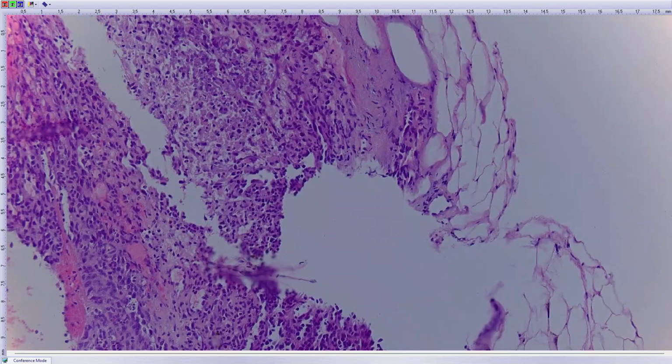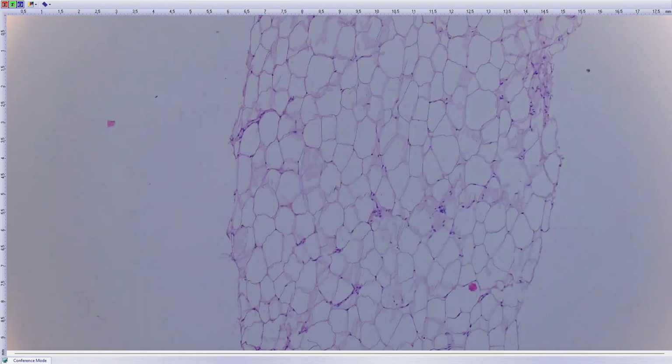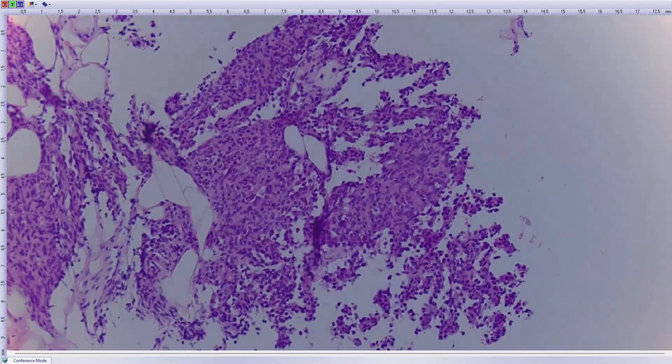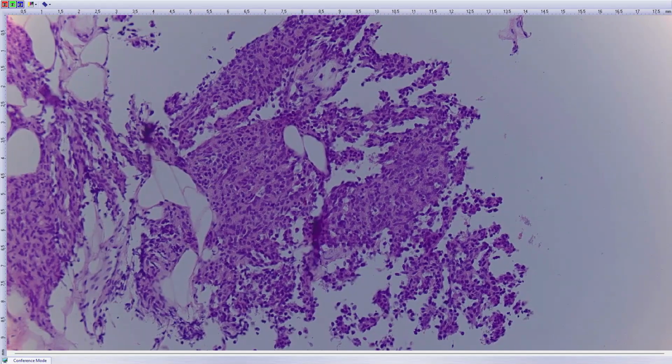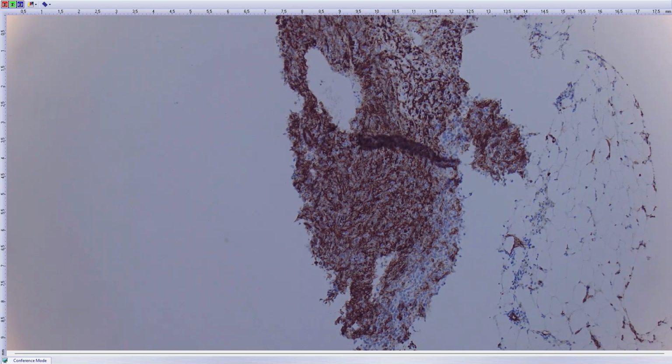And if you want me to show ERG, or CD31 or CD34, it's positive. Please, there. So the diagnosis is angiosarcoma of the breast, which is a very rare lesion. I will not be so self-confident to present here just small parts of it, but it's very current.